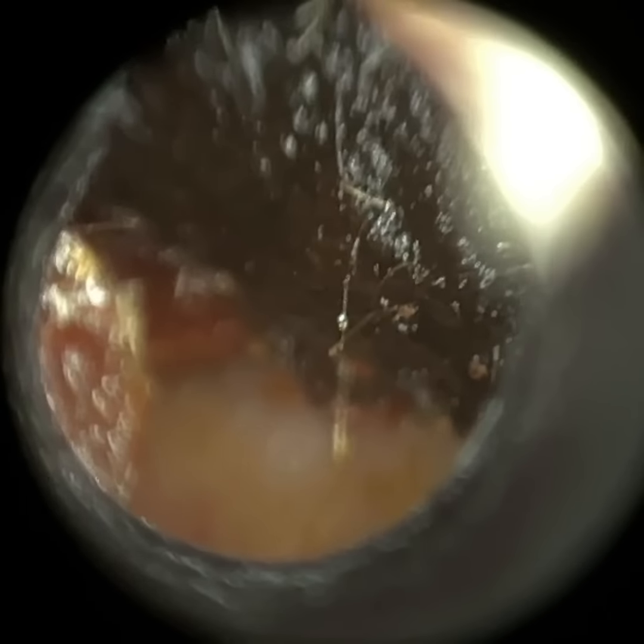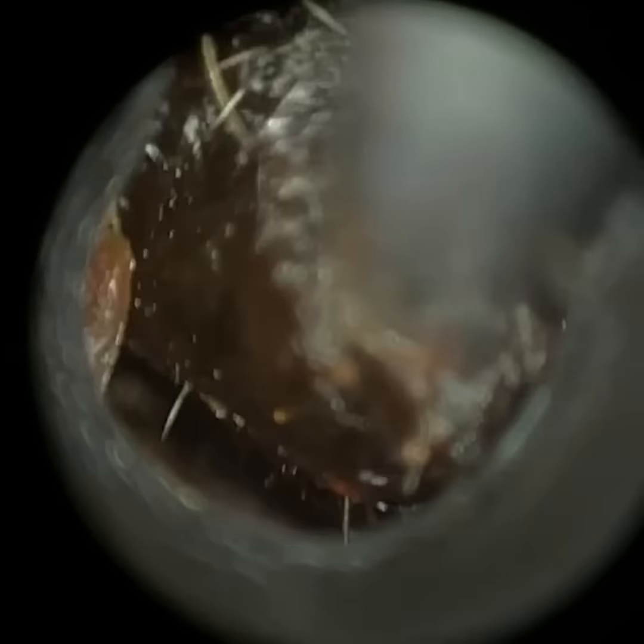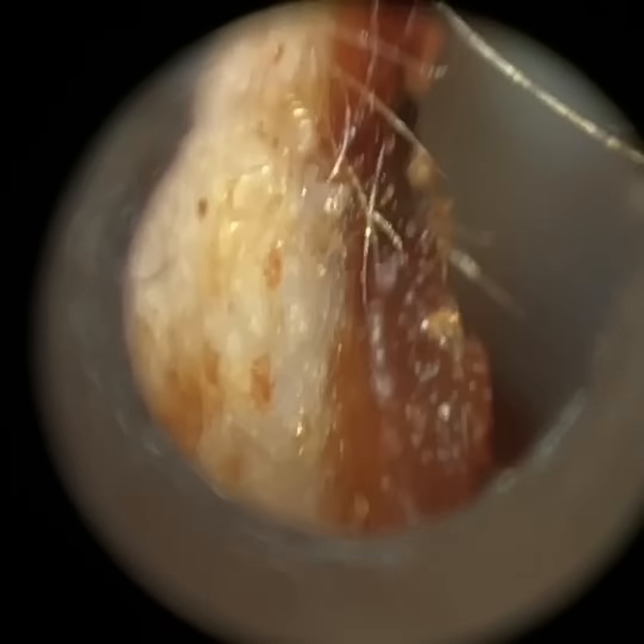This last piece of wax is quite deep in the ear. I decided to revert to the smaller speculum, but I'm not sure it made much difference because we can't stretch open the bony part of the ear canal. I think I probably would have got the same or even a better visual with the larger speculum where we stretched open the outer third. Something I've learnt here is that I could have just continued with the larger speculum. As you can see deeper in the ear, the speculum doesn't go that far into the ear canal anyway, as it's made up of bone.